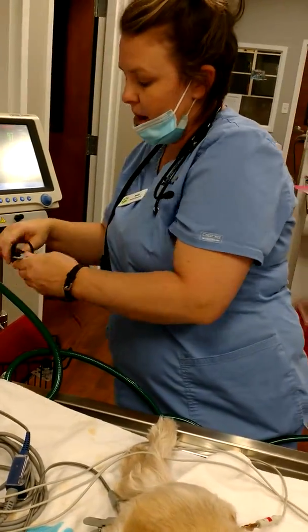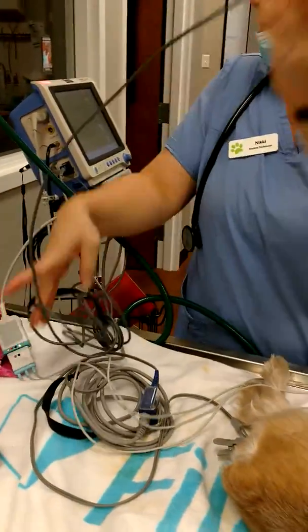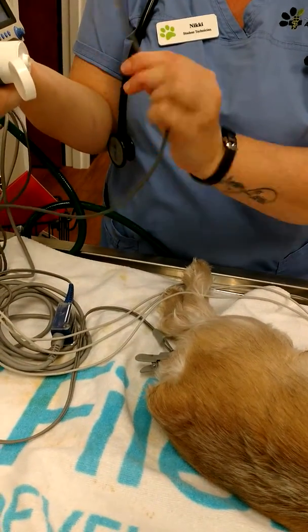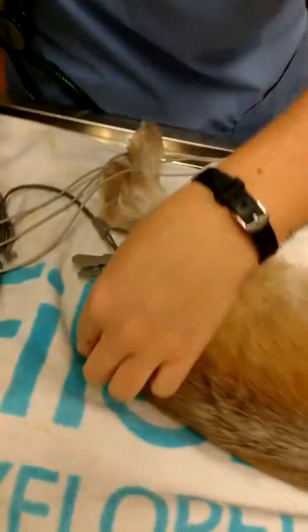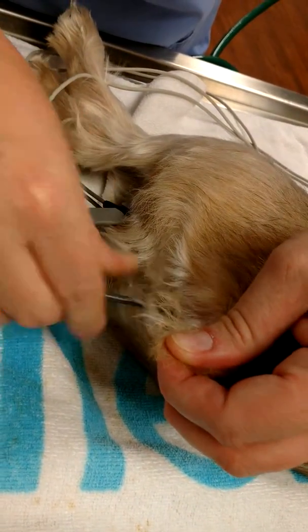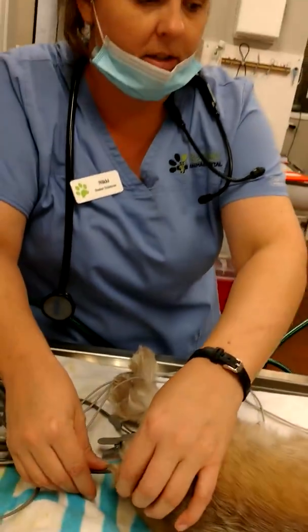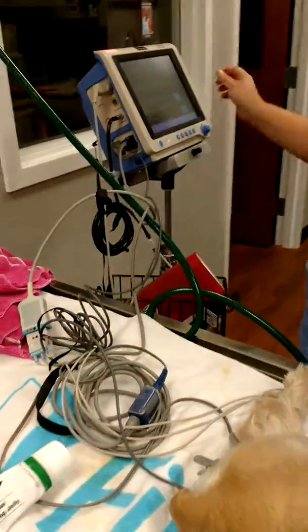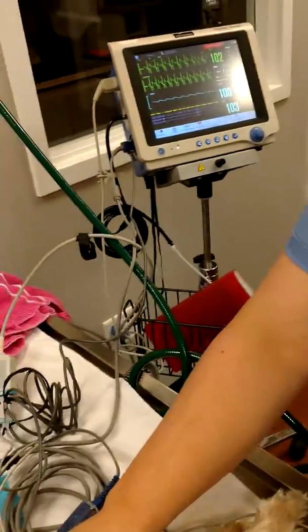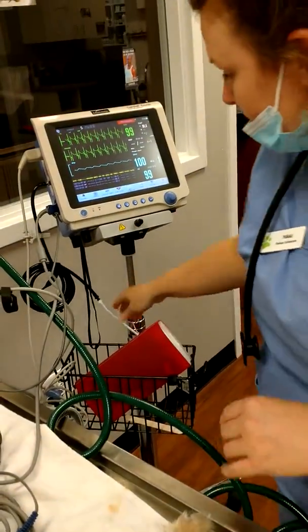We're going to do the thermometer probe, which is going to be rectal. Put some lube on it, and then we're just going to stick this on her rectum and gently advance that — which she didn't appreciate, as you can tell by her heart rate. The temperature probe will take a second to adjust, so don't expect it to go straight up to a normal temperature reading.